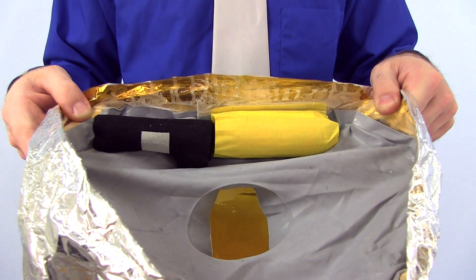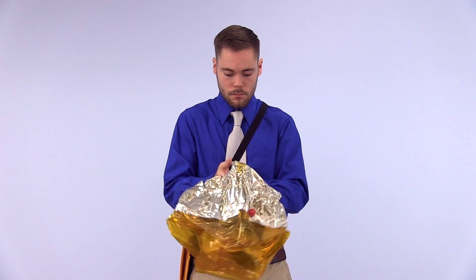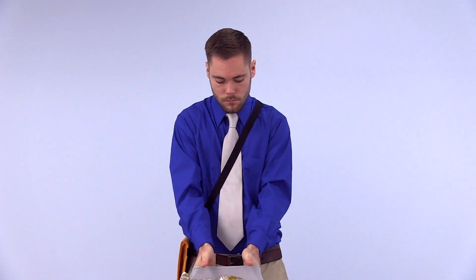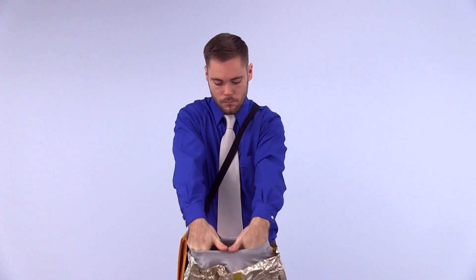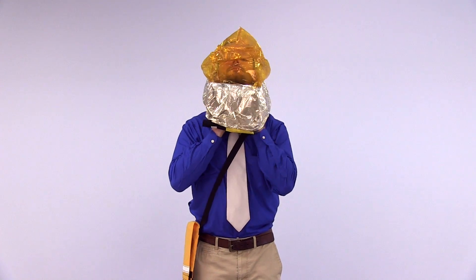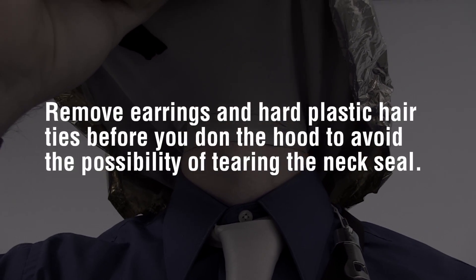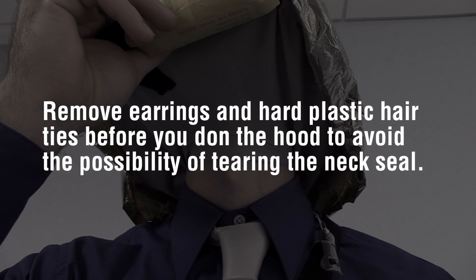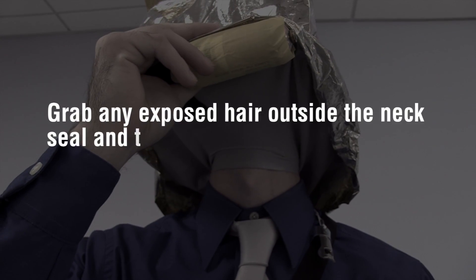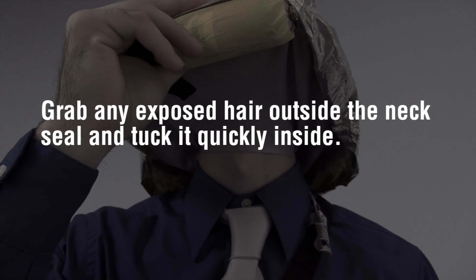With the oxygen bottle positioned closest to your body, place both hands, palms together, inside the elastic neck seal opening. Stretch the neck seal open, lean your body forward, and slip the hood over your head. Remove earrings and hard plastic hair ties before you don the hood to avoid the possibility of tearing the neck seal. Grab any exposed hair outside the neck seal and tuck it quickly inside the hood.